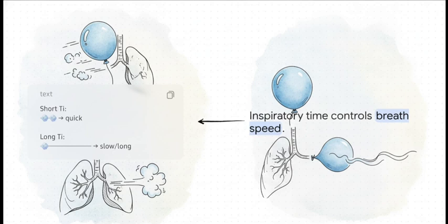But look, time isn't just about how often we breathe. It's also about how fast we deliver each individual breath.